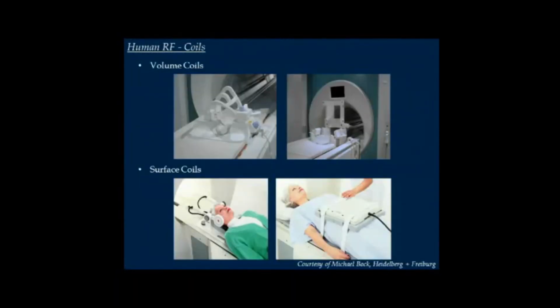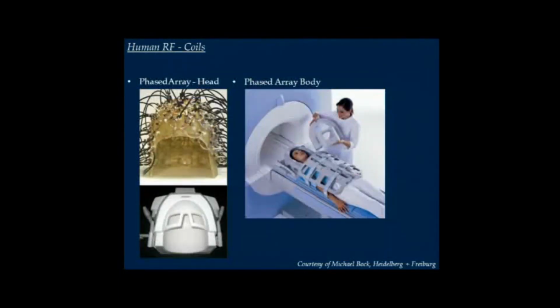Okay, now you have an overview on possible coil types and shapes. Which ones are in use? If you come to human use, you mainly have, not totally, but mainly have birdcage coils for volume resonators, and surface coils for areas where you just want to see a certain spot in the subject. More and more, especially in type of surface coils or questions addressing surface coils, phased array coils take over. Sometimes even in volume cases.